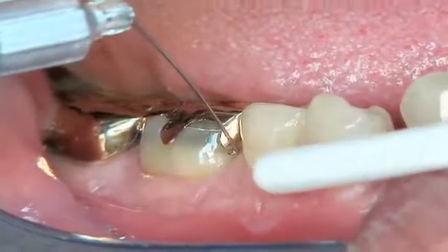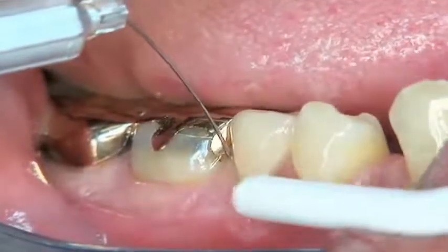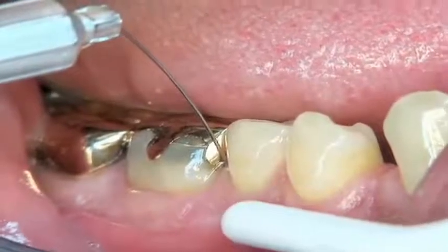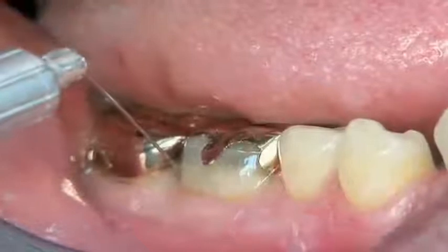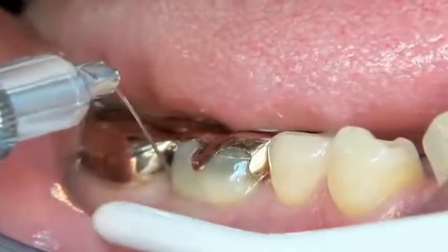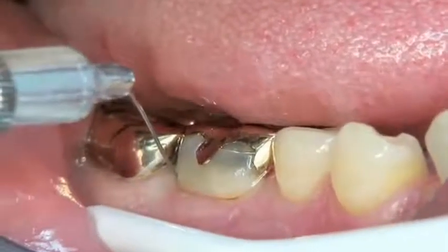When injecting, strong resistance is necessary on the syringe handle. This requires as much force as possible with the thumb. First the mesial, then followed by the distal insertion with strong back pressure. It has been reported that there is some post-injection pain, but it is mild.